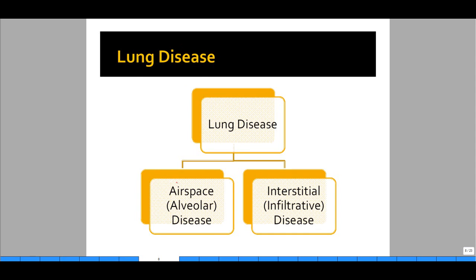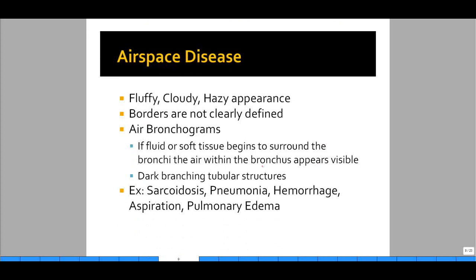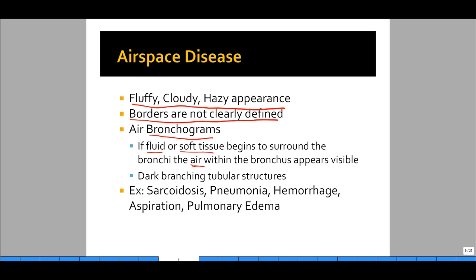Lung disease can be differentiated into two categories: one, airspace or alveolar disease, and two, interstitial and infiltrative disease. Airspace disease is generally represented by fluffiness, cloudiness, or haziness on a chest x-ray, with borders that are not clearly defined. We can see what's called air bronchograms — when fluid or soft tissue surrounds the bronchi, the normally invisible bronchus starts becoming visible, appearing as long, dark tubular structures. Examples of airspace disease include sarcoidosis, pneumonia, hemorrhage, aspiration pneumonia, and pulmonary edema.